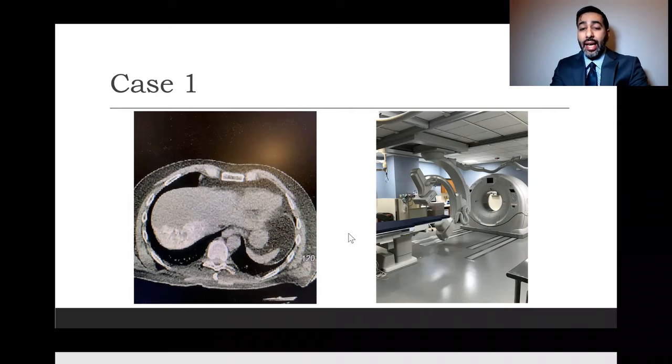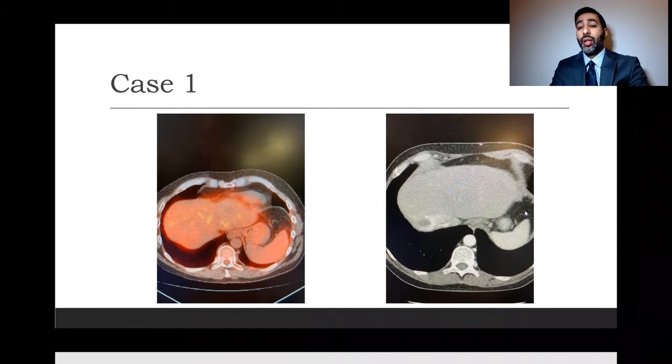That's a question that's often asked: how long does it take to do this, to go from CT to angio? Literally takes 5 minutes. The other question I get is, how long does it take staff to learn it? I would say fairly quickly. Within a couple of months, I'd say we were very efficient at it.